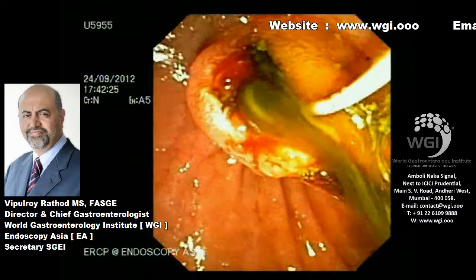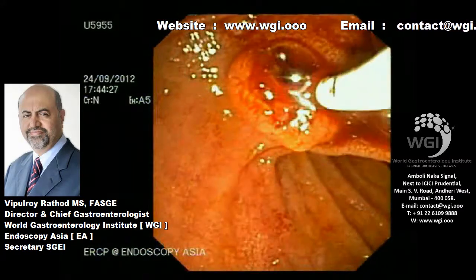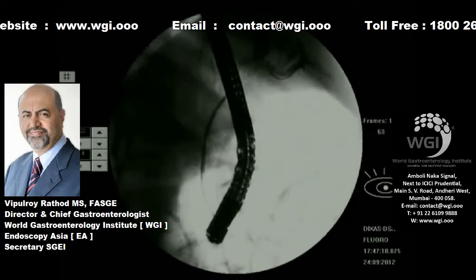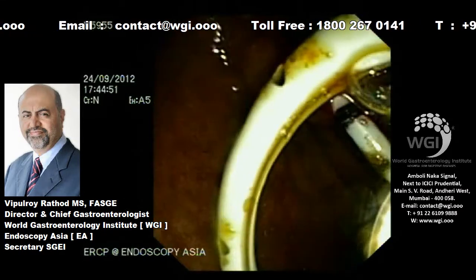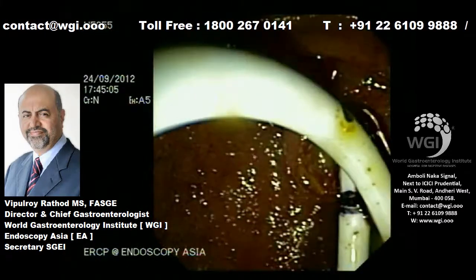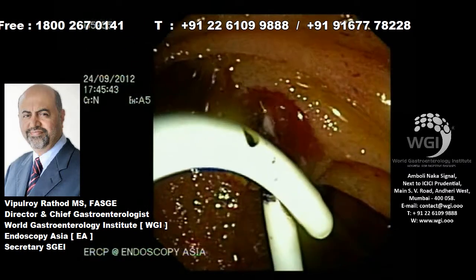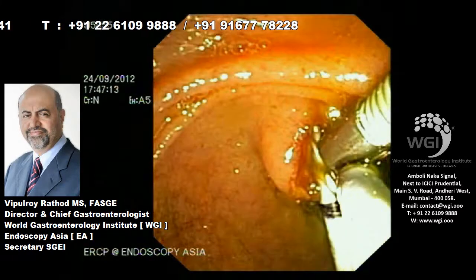to precipitate a more severe attack of pancreatitis. So once we have the infected bile and sludge draining out, we will leave a 7 French double pigtail stent here now for drainage and then evaluate this patient for a definitive choledochal cyst excision after this procedure. So again, in children, the EUS, ERCP, endotherapy interface is as poignantly applicable as what we see in adults as well.